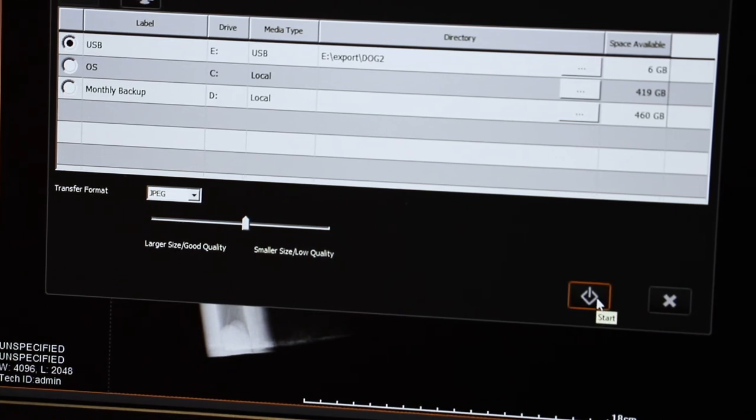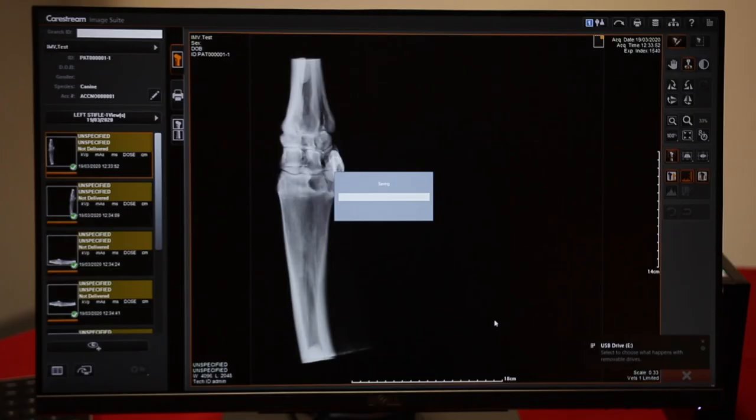Then start, and the files will start converting and moving over onto the USB stick.